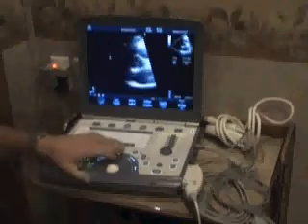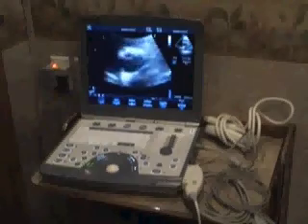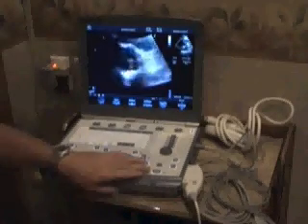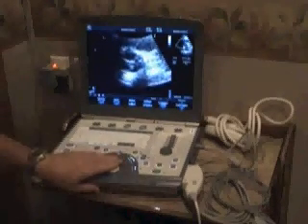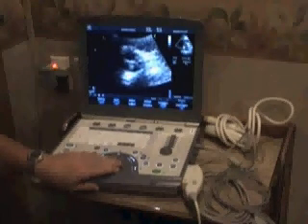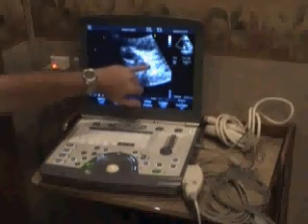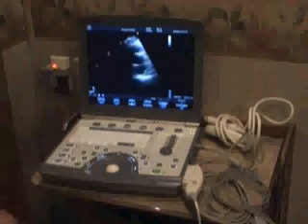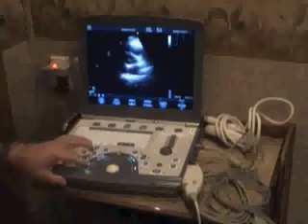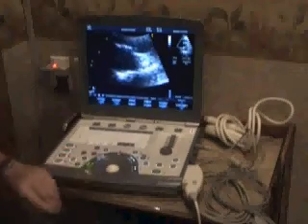You also want to zoom in and show the physician a nice clean aortic valve shot with all three cusps opening and closing. One of the things we cover — this little white or blackish area right here — would be my left coronary artery takeoff. So we'll go back and zoom one more time and save it: a nice clean picture for the doctor.